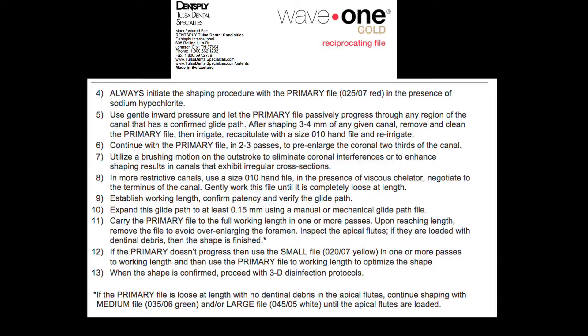We remove WaveOne Gold, observe the instrument, and clean the dentinal debris in the flutes of the instrument. We irrigate. You will see the needle go deeper and deeper. Then we take the instrument that established working length and ascertain that we have not blocked ourselves — it goes all the way to working length. Then we irrigate again and repeat the same process with WaveOne Gold until we reach working length.